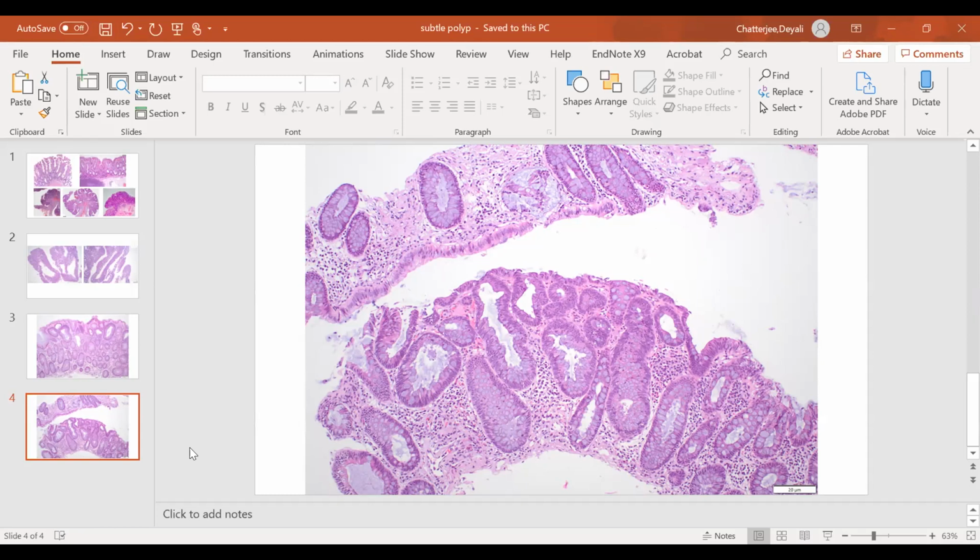In this case, there is no malignant transformation, but this is an SSA with dysplasia that will perhaps need close follow-up, especially because it was a large one. I think this patient may actually have sessile serrated polyposis, if you look back at all of the pathology.